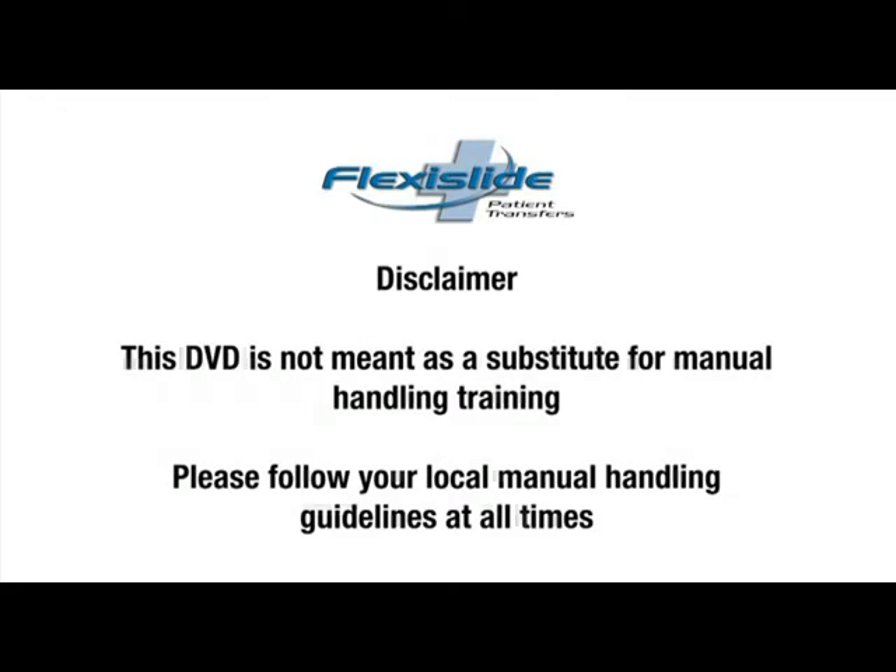The information in this DVD is based upon best practice and can be used to support existing manual handling training. It is strongly recommended that this DVD is not used as a substitute for manual handling training. Please follow your local manual handling guidelines at all times.